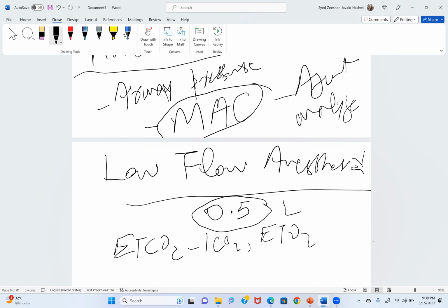It's not working, it's bypassed, and you are giving dry gases. Okay. And if you are using low flow anesthesia, you should have a very good agent analyzer. You should have a functional soda lime, and you should have monitoring of the inspired and expired gases and calculation of MAC value. Because in the monitors, you put the age and it will reflect a rough idea, of course not 100%, but you can have a trend.